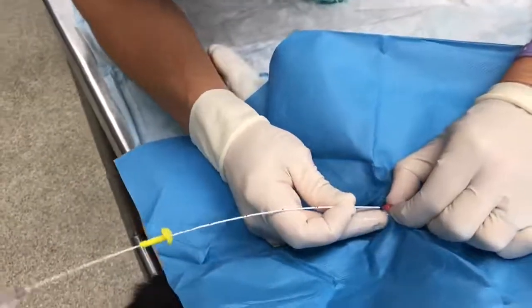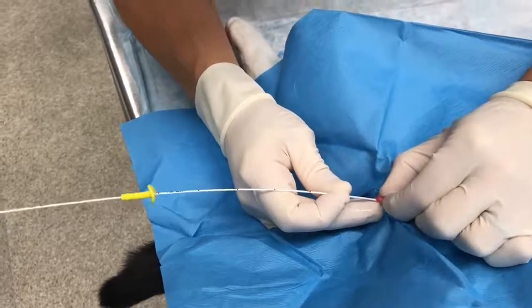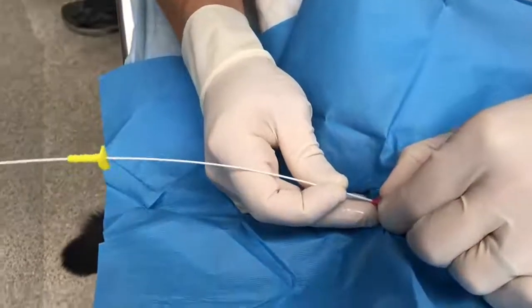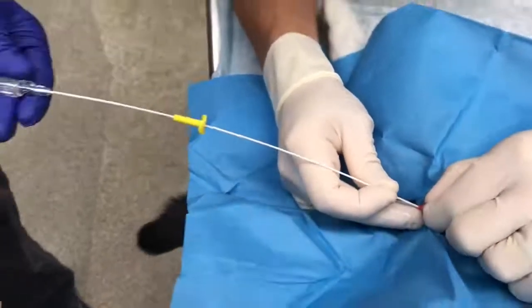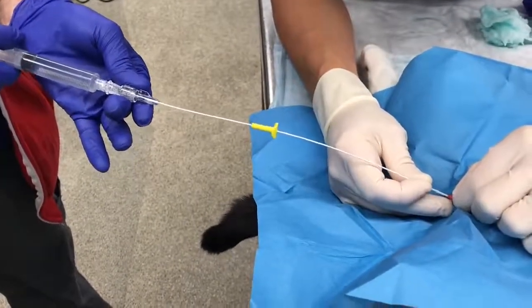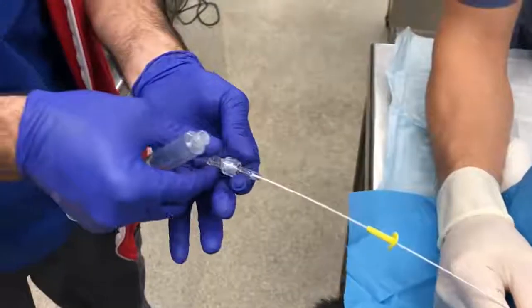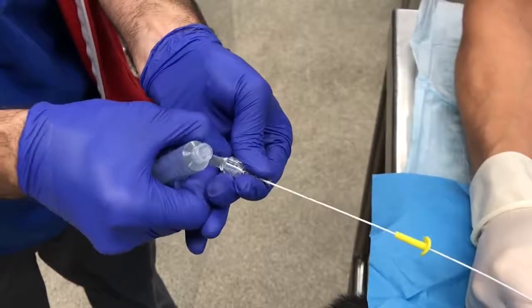Attempting this process again, extrude the penis and place the tip of the catheter within the urethra. Your assistant may attach a sterile saline flush at this point to perform retrograde urohydropropulsion. While flushing, you may gently move the catheter forward and backwards while remaining seated in the urethra. Remember to pull the penis within the prepuce caudally and dorsally to ensure that the urethra is straight.